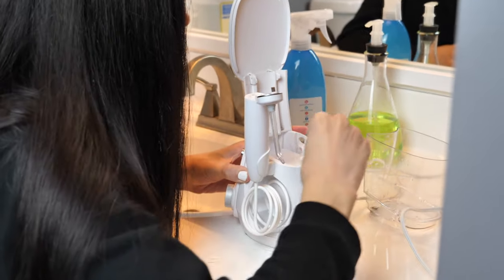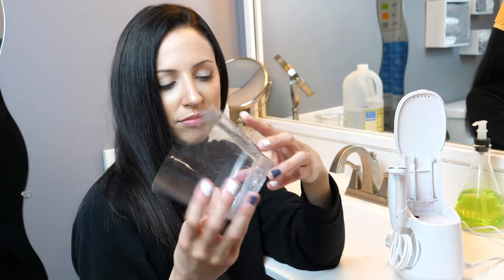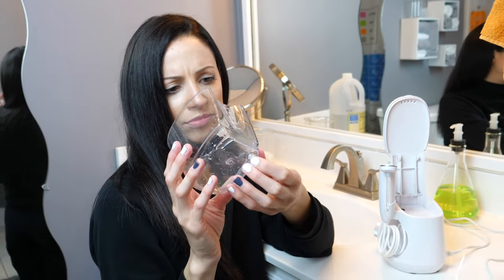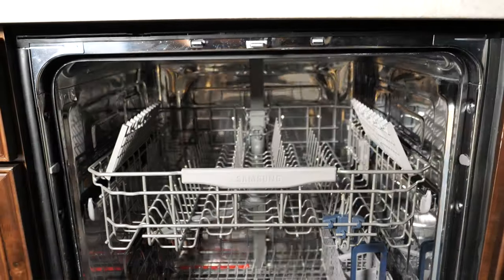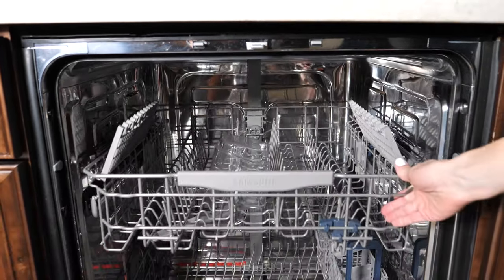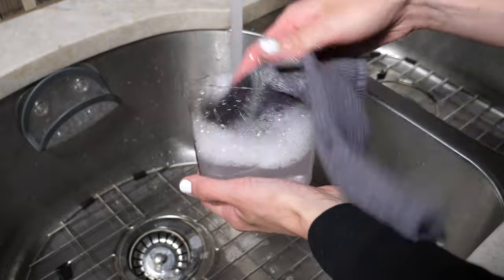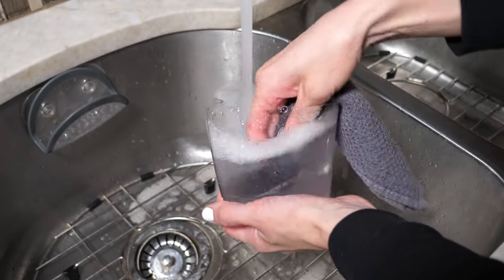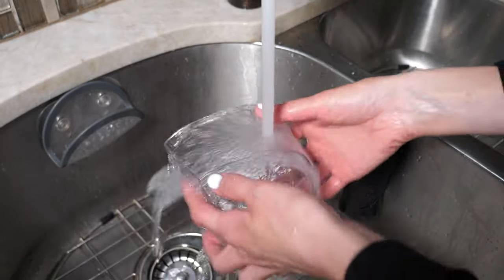Next, I clean the water basin. I take it off the unit — some units let you remove the black valve, but mine doesn't seem to. My water flosser's manufacturer instructions say it's dishwasher safe, so I put it on the top rack and let it air dry once it's done. If you don't have a dishwasher, just wash it with warm soapy water — works just as good. Sometimes I do that instead because regular sink washing is simple.